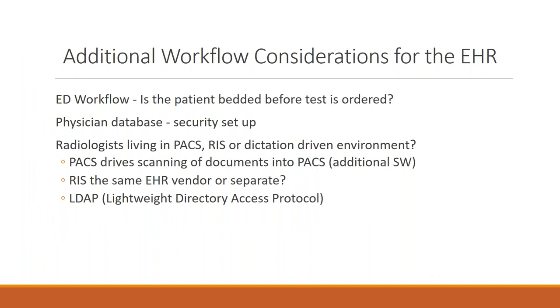Additional considerations in the implementations, particularly with the EHR. For some reason, ED workflow is often overlooked. Some of the simple things, like is the patient bedded before the test is ordered? That's going to have a different location for the patient of where that report's going to go back to or be available for. And it's going to be different on the HL7 information. If it's an ED patient, it would come across to your RIS system as ED. If they're bedded, then it might say bed 234 is where that patient is now, coming across with this information. So it is important to understand that scenario.